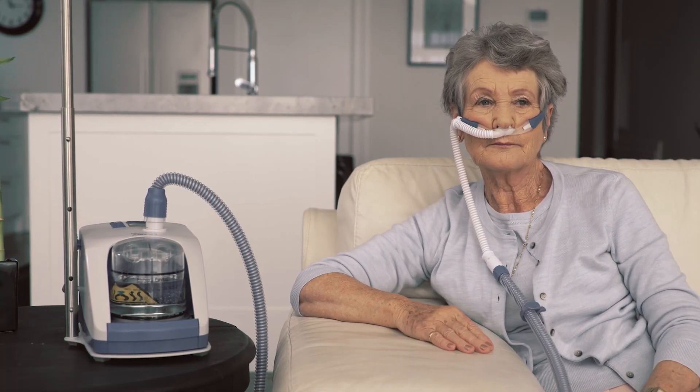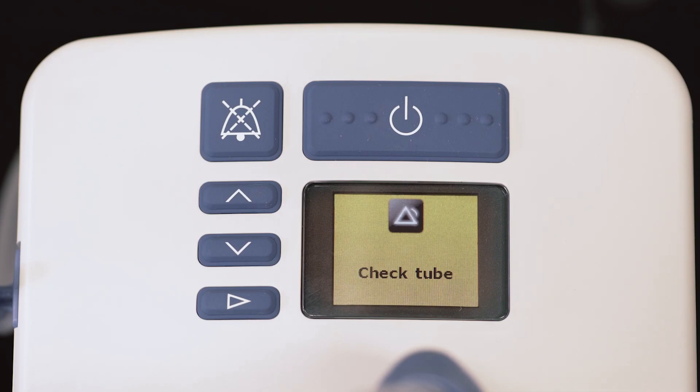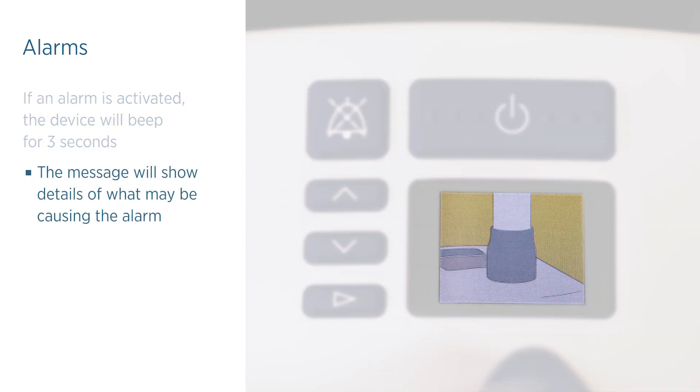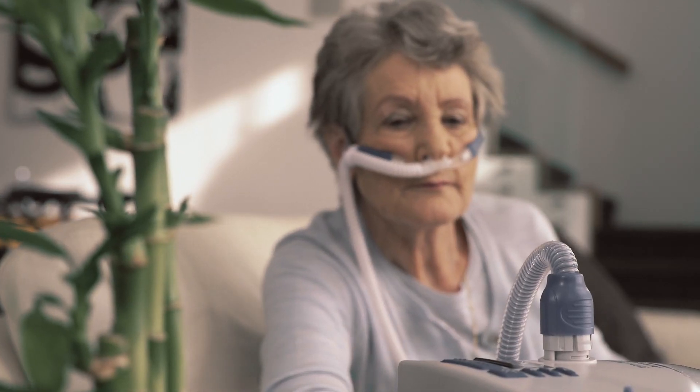The MyEVO2 has visual and auditory alarms to warn you about interruptions to your treatment. If an alarm is activated, the device will beep for three seconds and show an alarm message on the screen of the unit. The message will show details of what may be causing the alarm. The alarm can be muted by pressing the mute button.